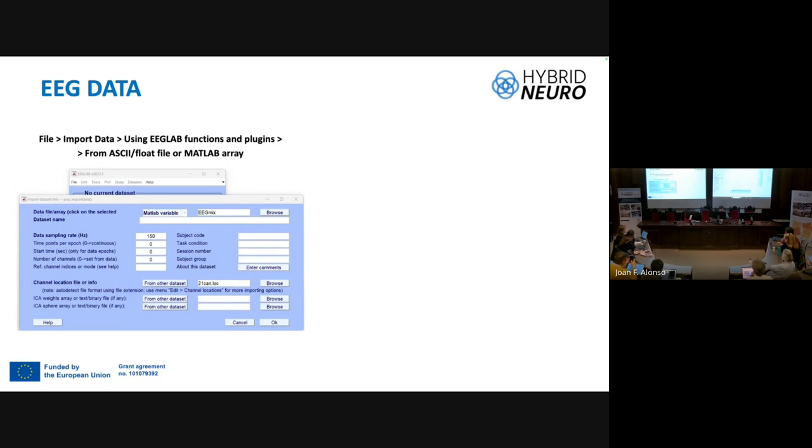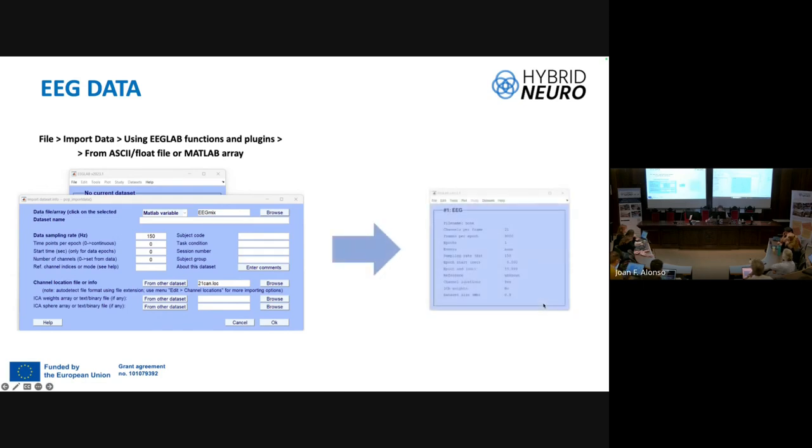Browse. The location file is called 21 CAN, okay? When I do it, I put okay, and name it, I don't know, EEG. Okay, and we have here the information in EEGLAB: 21 channels, 9,000 samples, and the sampling rate.